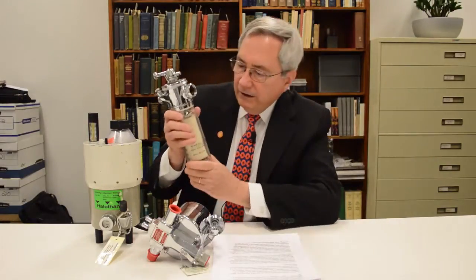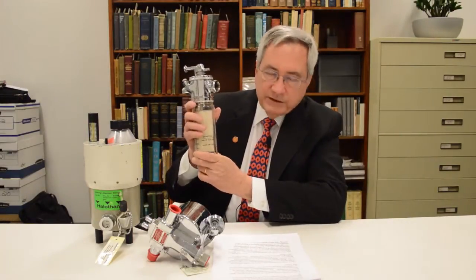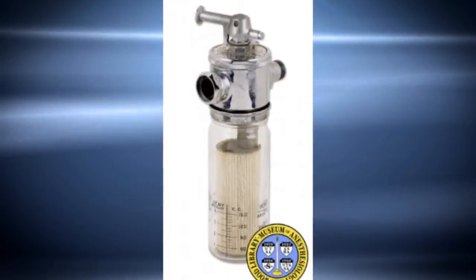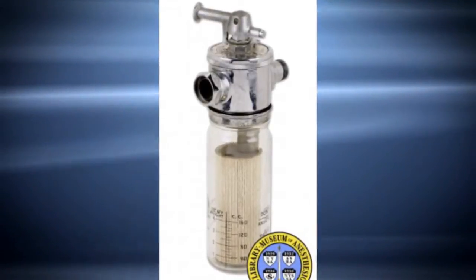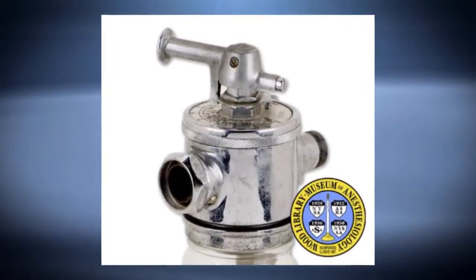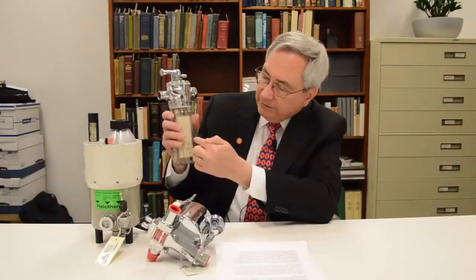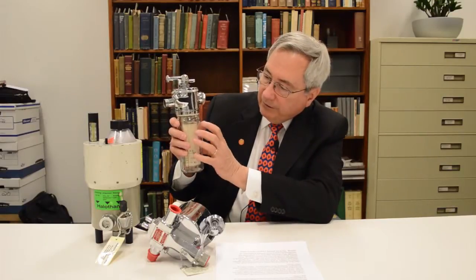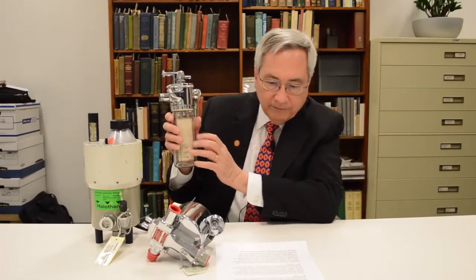The Ohio No. 8 vaporizer was available from the 1930s into the 1960s. It was introduced for use with diethyl ether, but could have been used with other agents as well. The liquid anesthetic would be poured into the glass container. It would be carried up onto the cotton wicking.